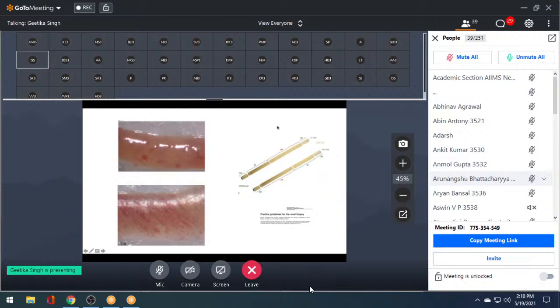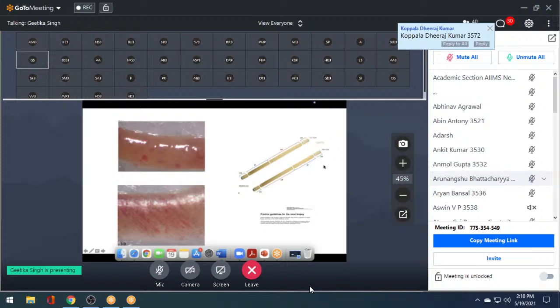So, somebody was asking me this as well. Let's quickly go through how we look at our kidney biopsies and our approach, which is how we actually come to the final diagnosis. Okay. So when a kidney biopsy comes into the lab, we don't do this for all our biopsies, but we like to do it for as many as we can. We will do a fresh tissue evaluation. Okay. And what we're looking for is to make sure we have cortical tissue. And we can identify cortical tissue here by these red dots. And you know what these are? These are, of course, glomeruli. Okay.